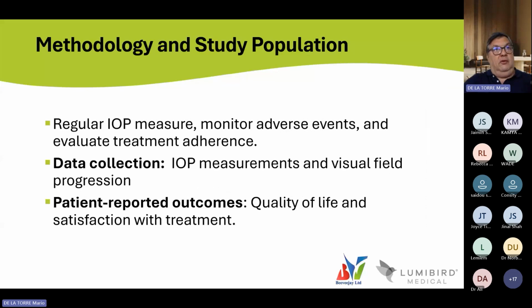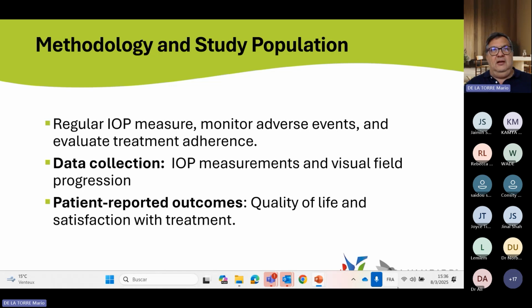The follow-up was regular intraocular pressure monitoring, monitoring adverse events, and evaluating treatment adherence. Why? Because one of the fears that we had in the past, doctor, is whether the intraocular pressure really decreases when we are using laser. Are there some adverse events? And are people happy to have that kind of treatment?